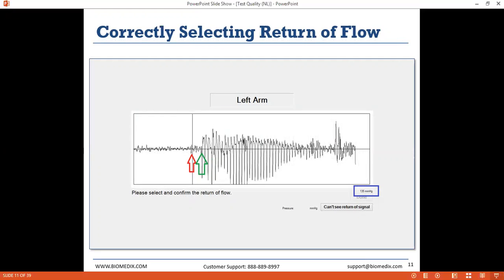Often, especially in the arterial webinar, because we have so much material to cover, I can't show you several charts to show some variation. So this is a more real-life study and is probably a little bit closer to what you're seeing on a return to flow trace. Now, there are a few differences, but there are also a lot of similarities that I want to highlight.